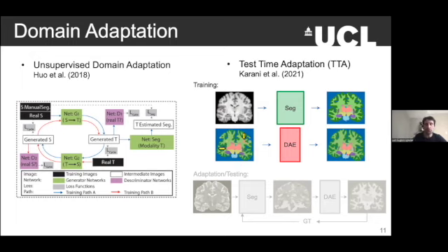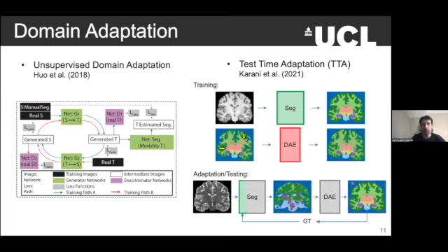Something that you can do is to say, okay, if I start from a T2 or any other scan that is not a T1, I segment and I get garbage. What I can do is push the segmentation through my denoising autoencoder, and then provide feedback all the way back here, right? To wiggle the weights of this network until I get a segmentation that looks plausible according to the denoising autoencoder.